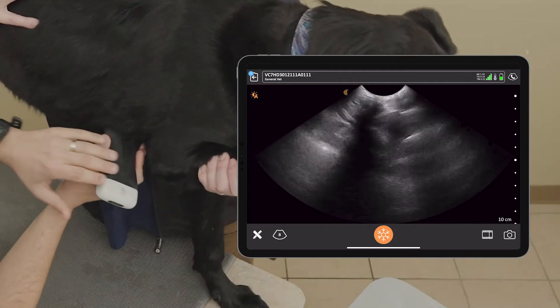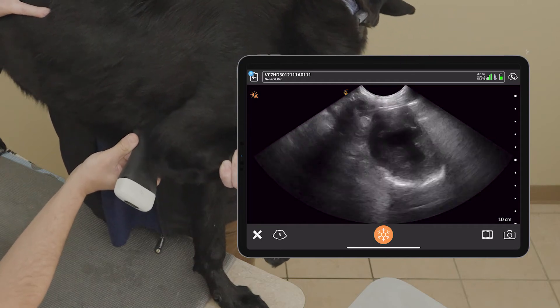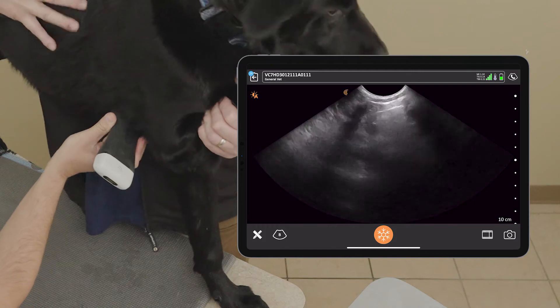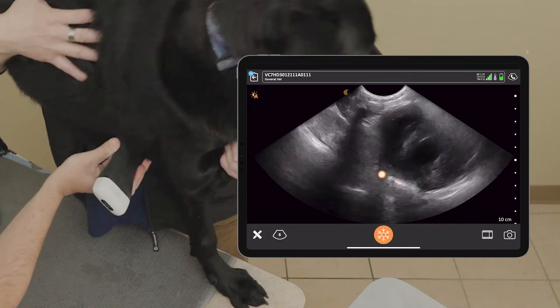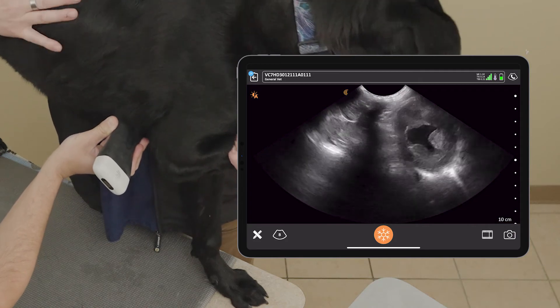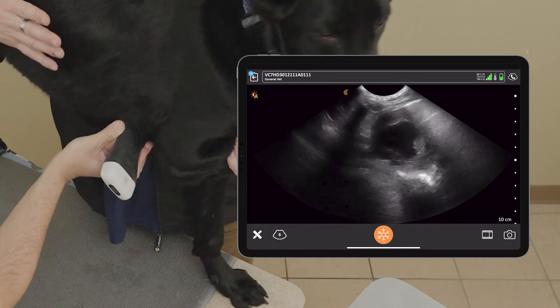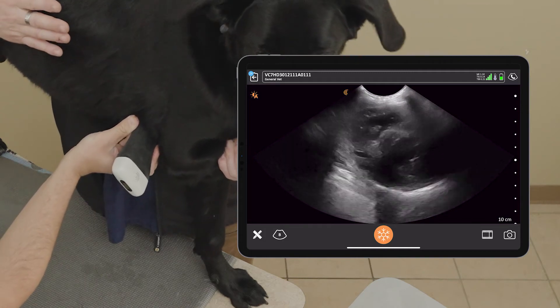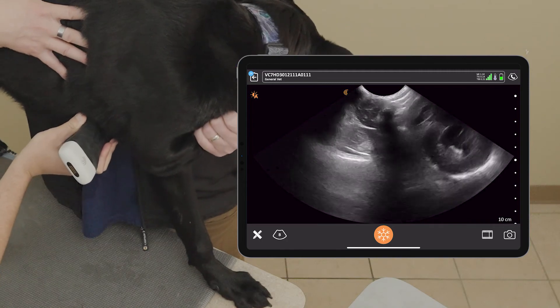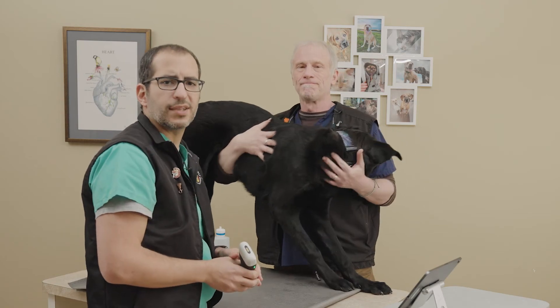One last thing — when you're looking at that heart, remember to recognize those chambers. We have the left ventricle, and right on top is the right ventricle, and around it is going to be the pericardial sac. As long as you know your heart chambers, you won't mistake anything for pericardial effusion. You'll see we don't have the perfect window — we've got a little bit of lung coming in and some rib shadow. But we're not cardiologists; we're looking to answer yes/no binary questions. Is that left atrium enlarged? Yes or no. Is that right ventricle enlarged? Yes or no. And that is our cardiac point-of-care ultrasound.